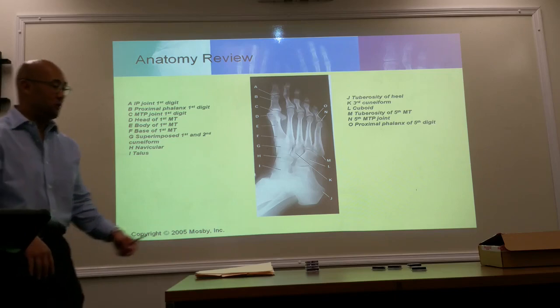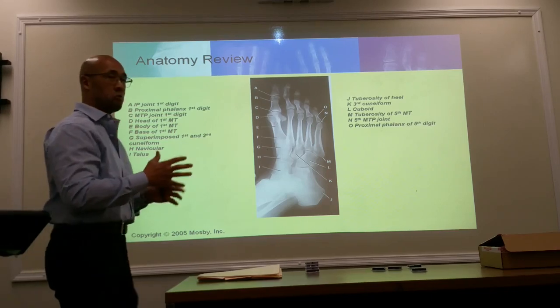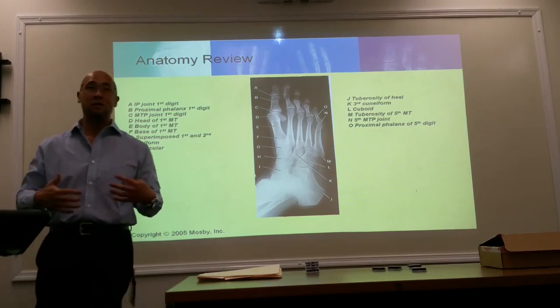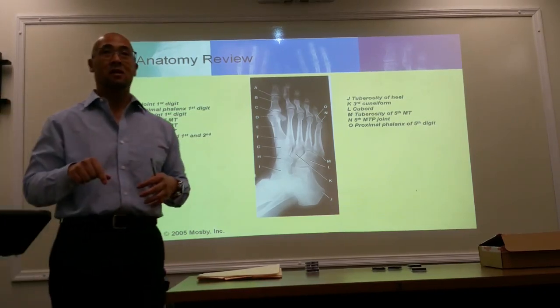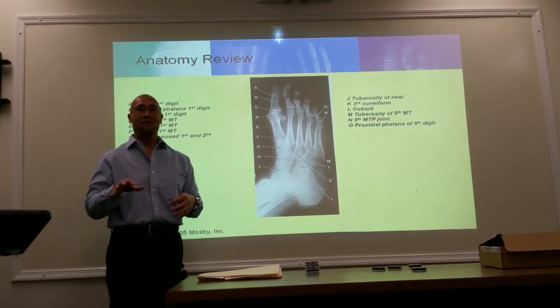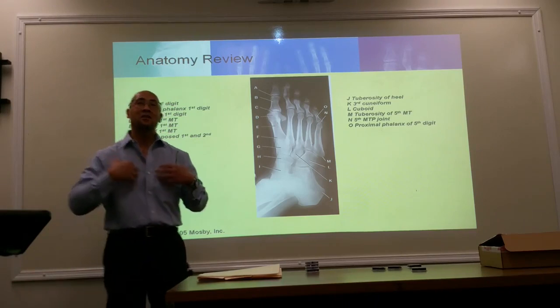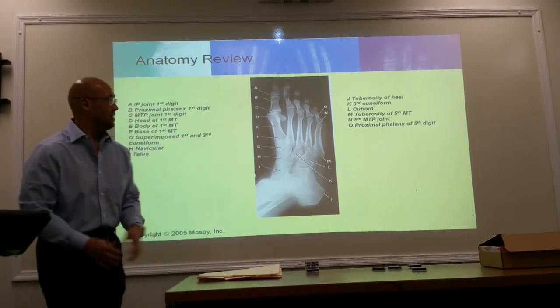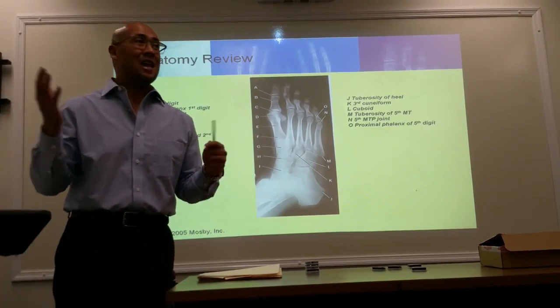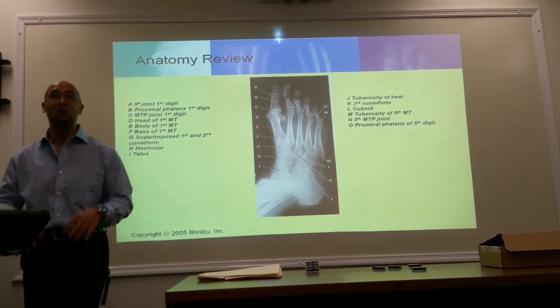Before you guys started wearing uniforms, and because I've been lecturing this material for a very long time, our students would dress in their regular clothes. So when we began lower extremities, I would instruct the females not to wear skirts. Why? Because we're frog legging, and your legs are going to be all over the place. You want to maintain modesty, right? That was my concern with the students coming in when we practice. Is that a concern for your patients when they're flopping their leg inward and outward? When you're dealing with the lower extremity, you have to maintain modesty, making sure that the parts are covered at all times.